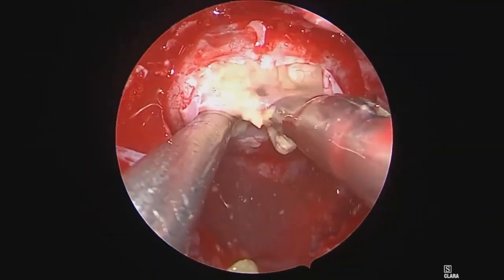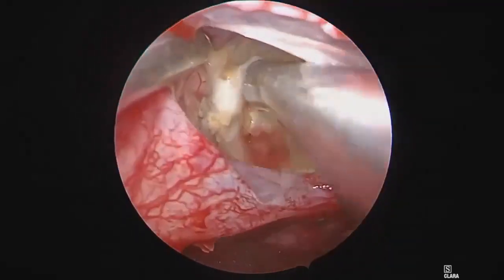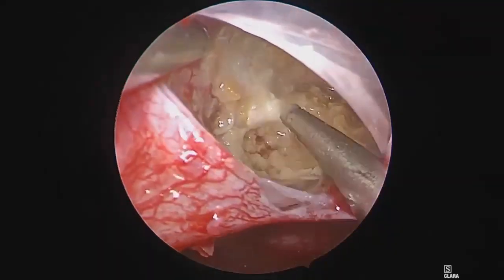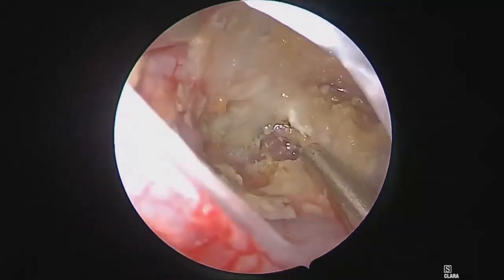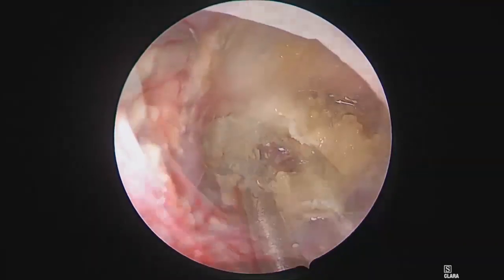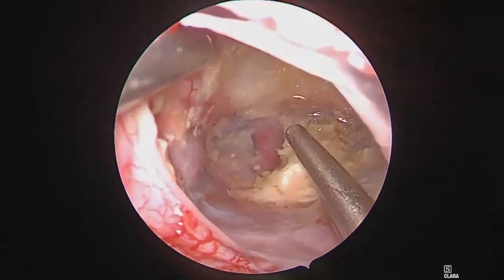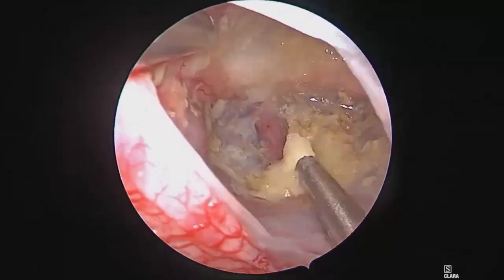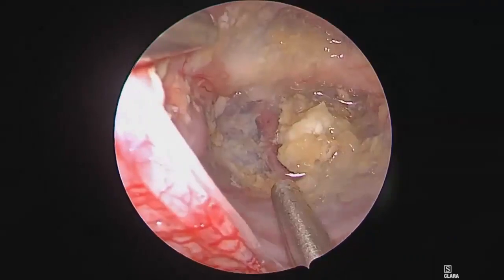As you can see here, there's immediate CSF egress from the suprasellar space. Further debulking is done to decompress the optic apparatus. As more dermoid is removed, one can see here the pituitary stalk in direct visualization towards the very back of the surgical cavity, with the optic chiasm and the optic nerves superior in the field.